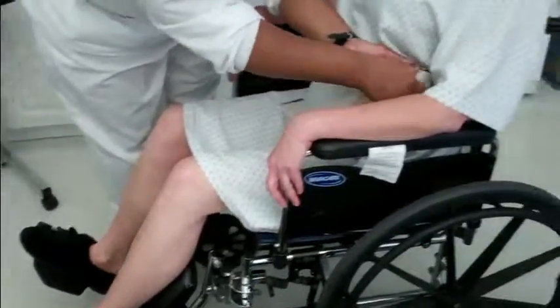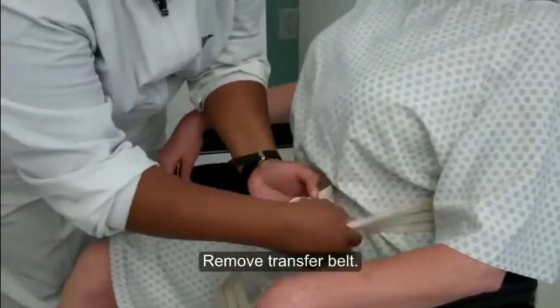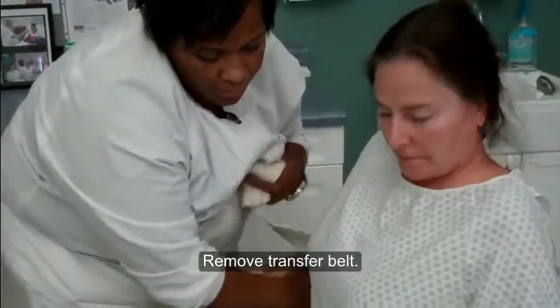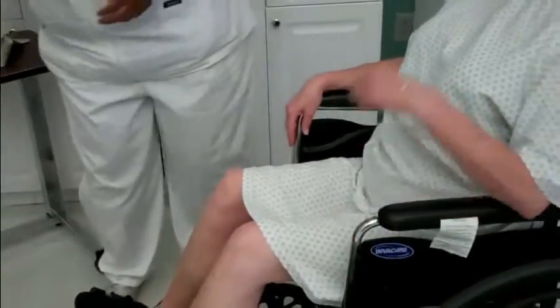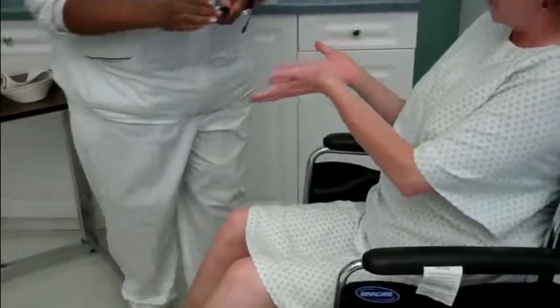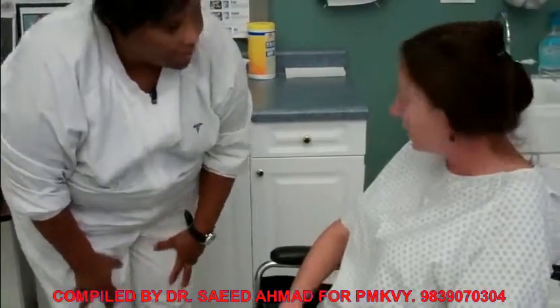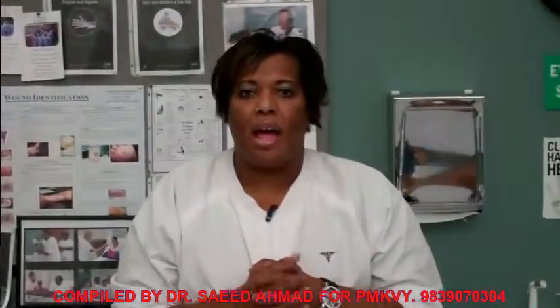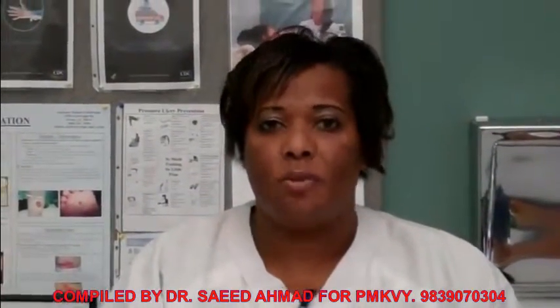I'm going to take the belt off. I'm going to give you your call light so you can call me when you're ready to go back in the bed. Is there anything else I can get you? I'm fine. Thank you. That includes the skill of transferring the patient from the bed to the wheelchair.